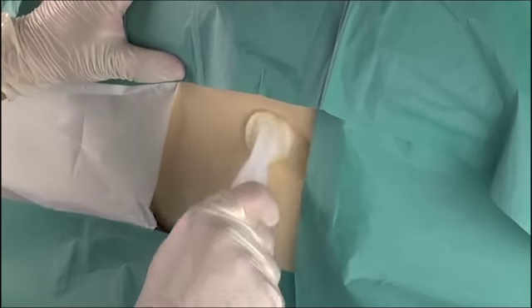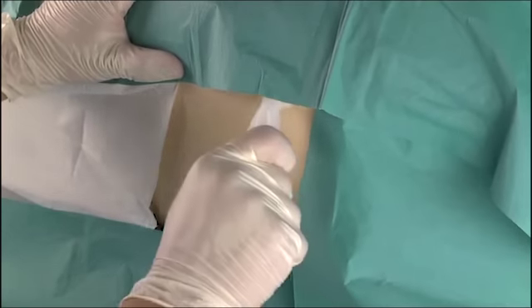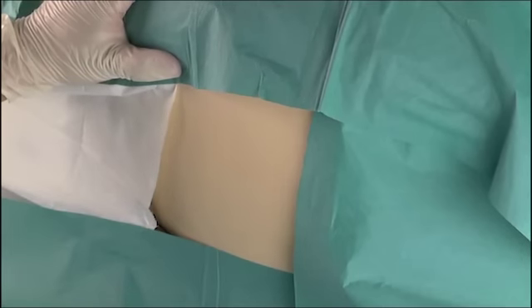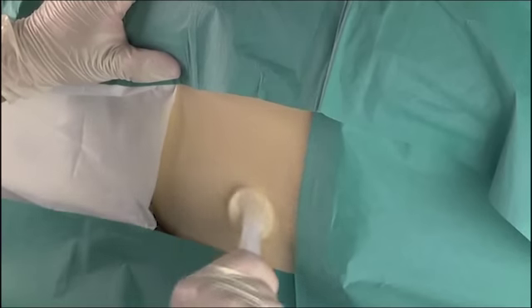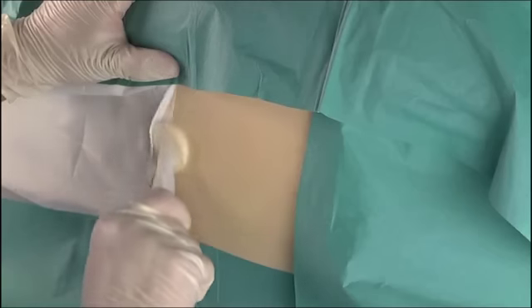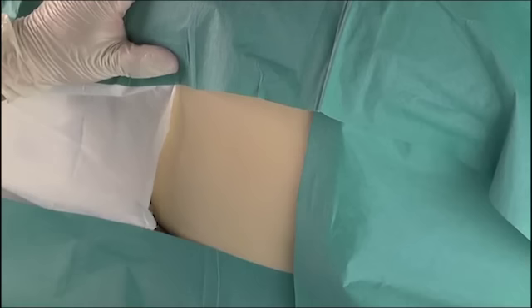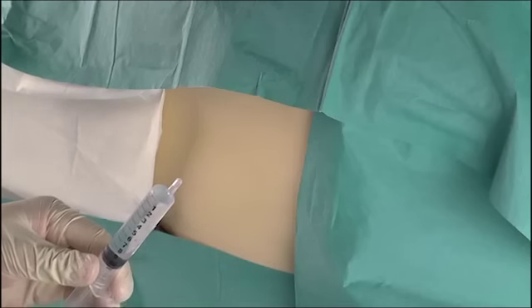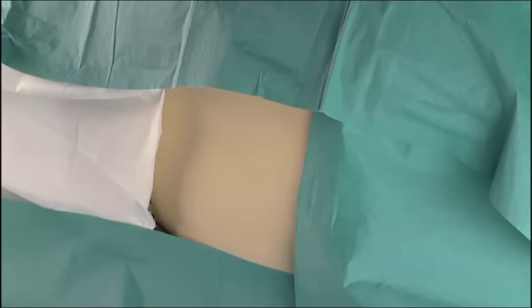Use an alcohol-based sterile cleaning solution to sterilize the skin, such as a chloroprep. Repeat this procedure twice, again with outward spiraling circles. Now anaesthetize the skin using lidocaine, provided the patient has no allergies. Remember to change the needle from that you drew up with.